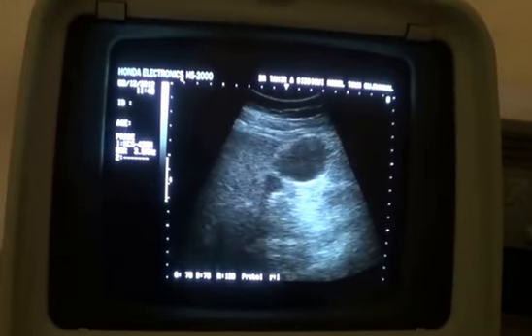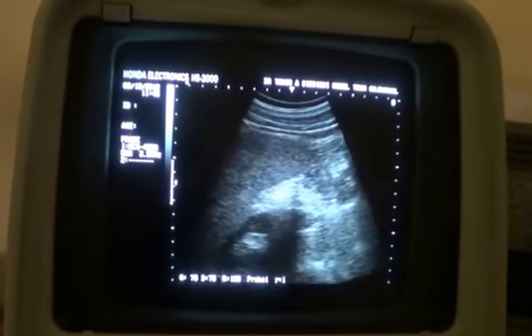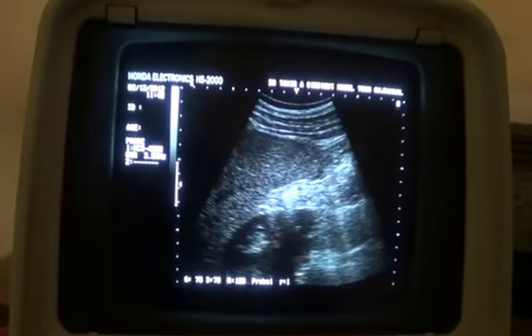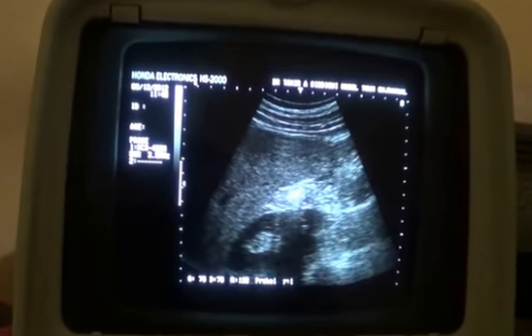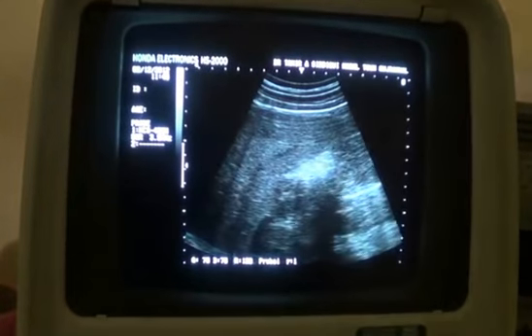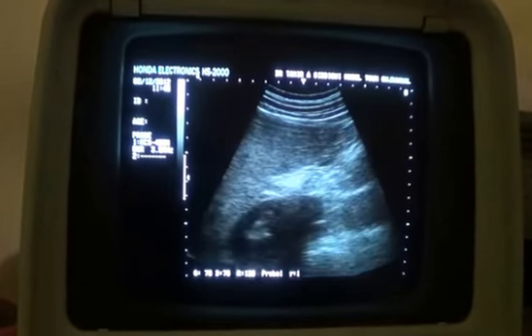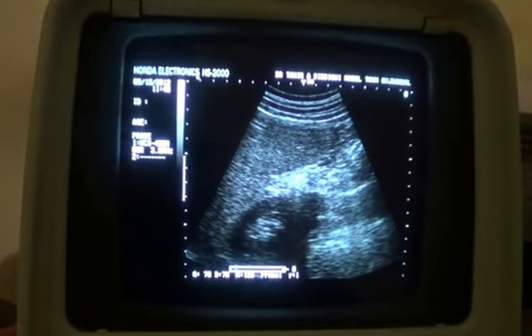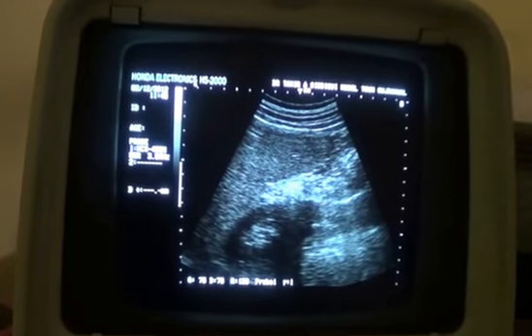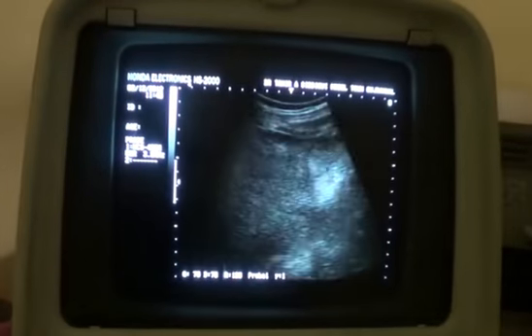Now see the kidney. Does the liver exceed the lower pole of the kidney or not? Patient is in supine posture, and here you see the kidney, lower pole of the kidney. Let me get a better view.